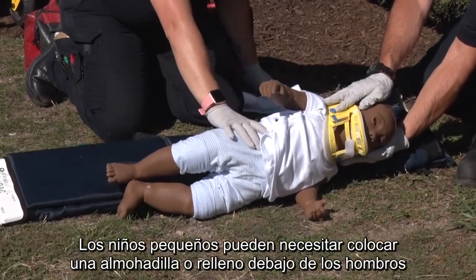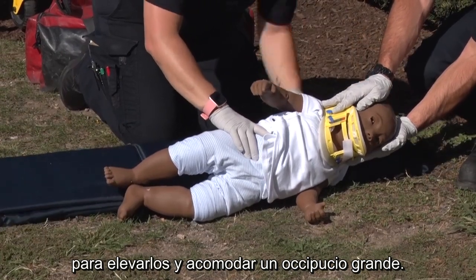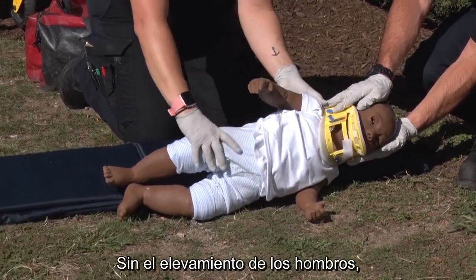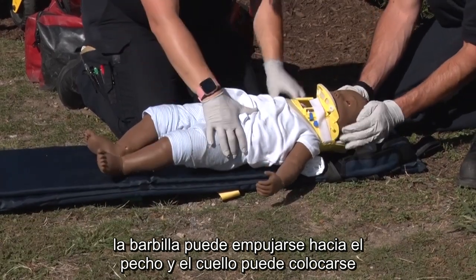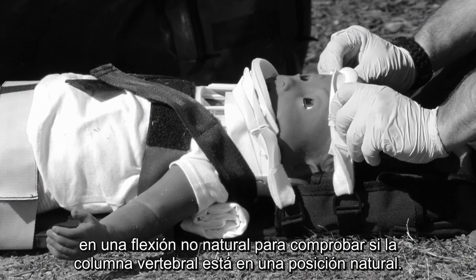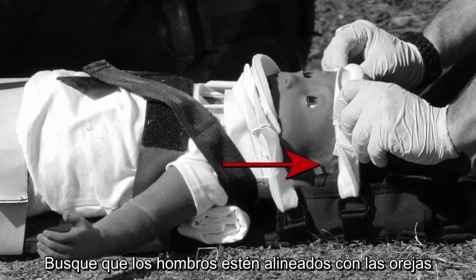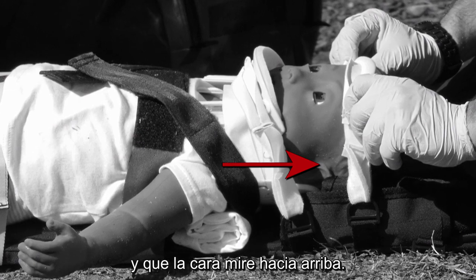Small children may require a shoulder roll to elevate the shoulders and accommodate a large occiput. Without the shoulder roll, the chin can be pushed down toward the chest and the neck placed in unnatural flexion. To check for the spine in a natural position, look for the shoulders to be in line with the ears and the face looking straight up.